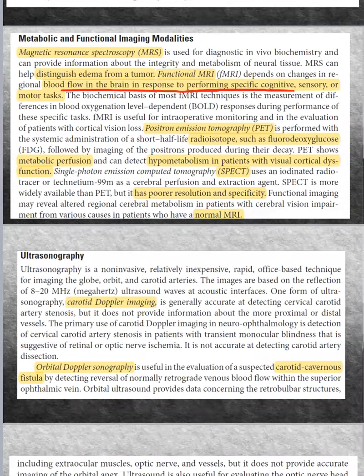Okay, what is the functional MRI? You can have an idea of the blood flow. So, Dr. Noura, you can say me, and after that I'll say that the blood flow is good to the occipital lobe in order to see me well. Something like that. If you are hungry, the blood flow will be higher to the hypothalamus in order to feel hungry, and so on.